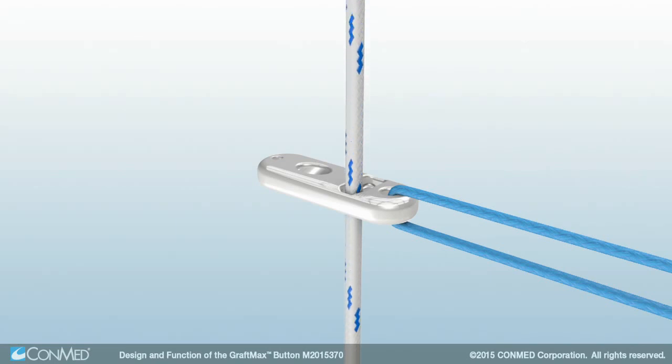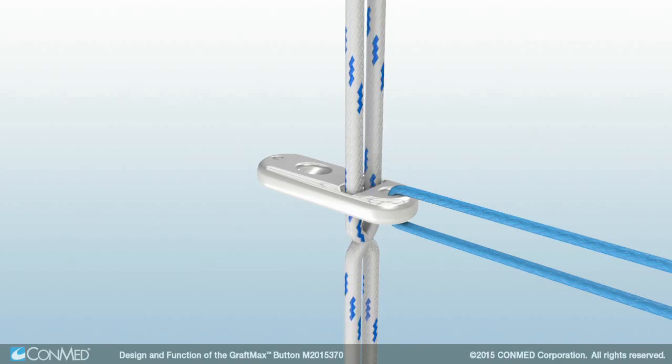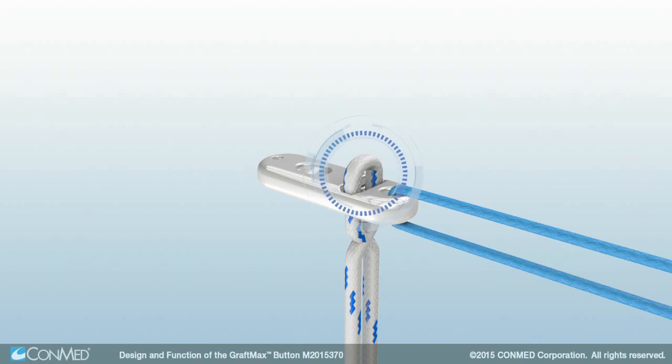A titanium button is combined with No. 5 Hi-Fi Suture. This ultra-high molecular weight polyethylene suture is assembled featuring a locking loop which sits above the locking pocket on the top of the button.